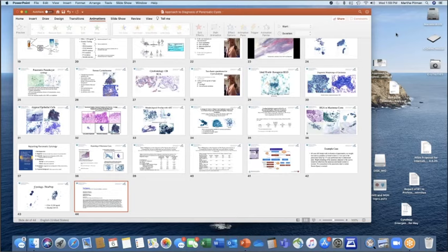So then all you're really left with is question number 2. Do you see high-grade epithelial cells or not? And your molecular testing would add support by just showing you the mutations. So if you said you saw high-grade epithelial cells, that's important. You're following the criteria, you're distinguishing them from low-grade cells.